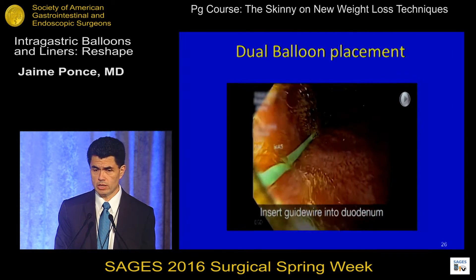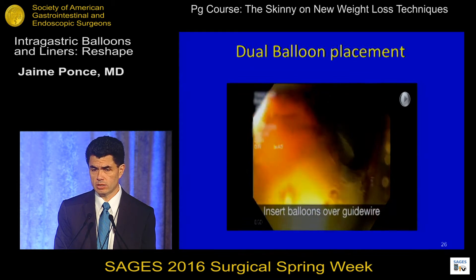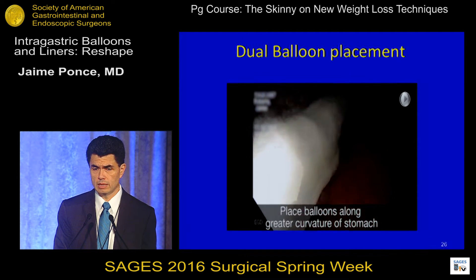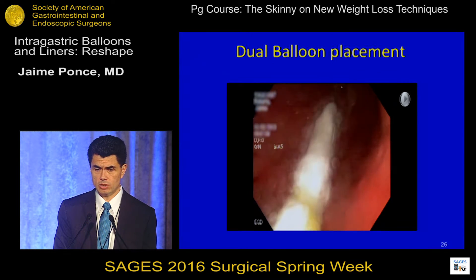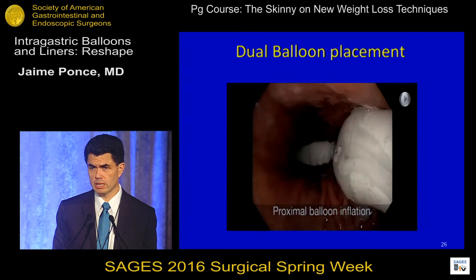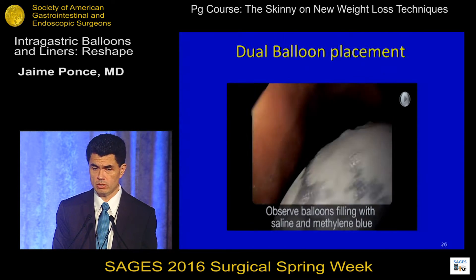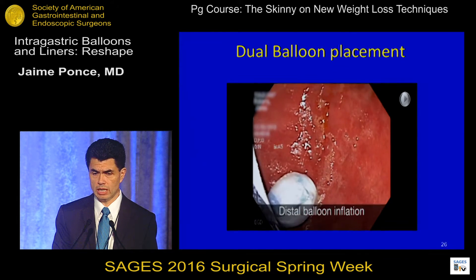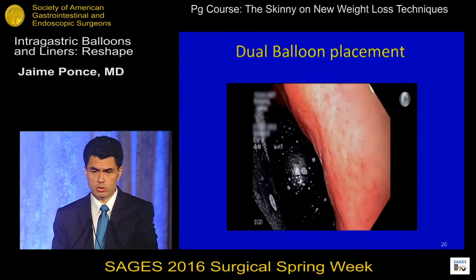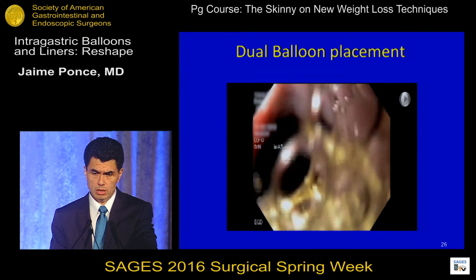In this video, the wire is placed in the first portion of the duodenum. The scope is removed, and then through the wire the balloon device is slid in. Under direct visualization, the proximal balloon is inflated first and then the distal balloon — this is placement in the greater curvature. Why first the proximal? If you inflate the distal first, it pushes back up into the EG junction, so you ensure the proximal balloon stays in the stomach before inflating the distal one. When both balloons are inflated, the stomach capacity is reduced as both balloons occupy the body and fundus of the stomach, and then the introducer is removed.